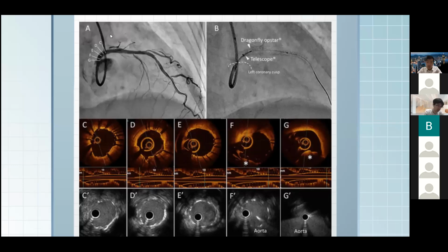So firstly, in modern days, cardiologists in the catheter lab will use all of the aforementioned imaging modalities for a normal patient, say without renal problems, such that we can better optimize the stent placement, the placement of the balloon stent itself, as well as optimizing the different sites, as well as understanding the prognosis of the patient after the stent implantation.